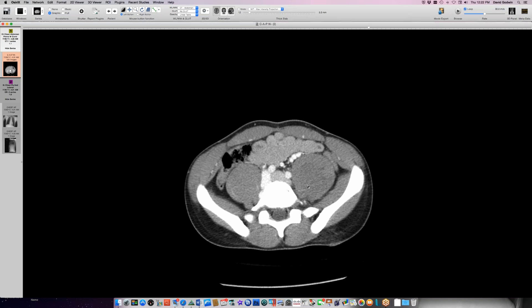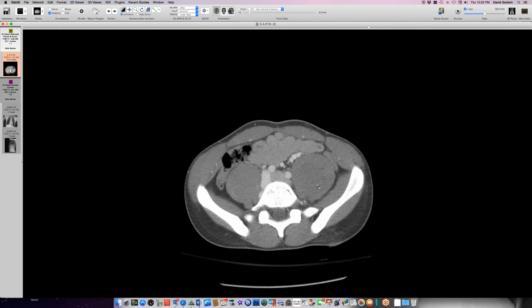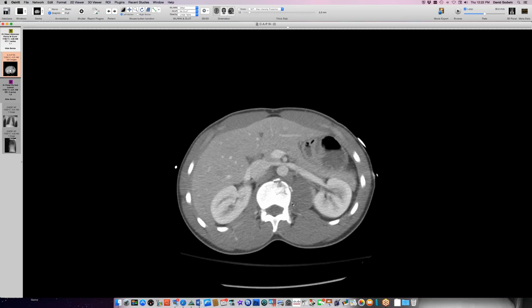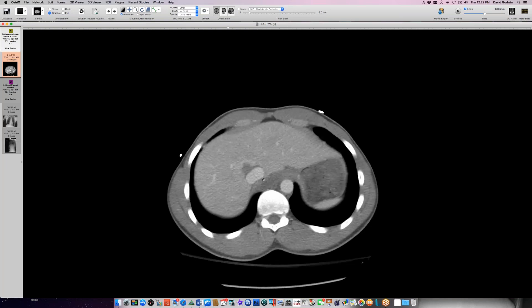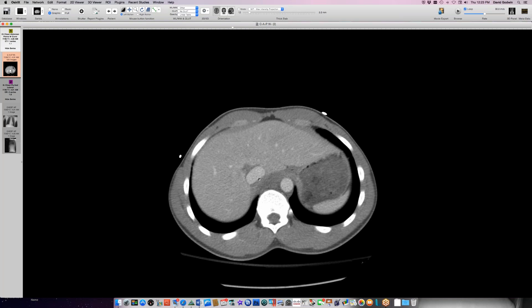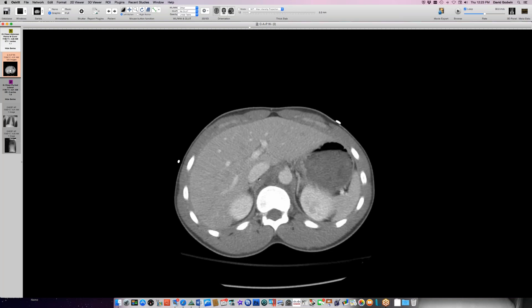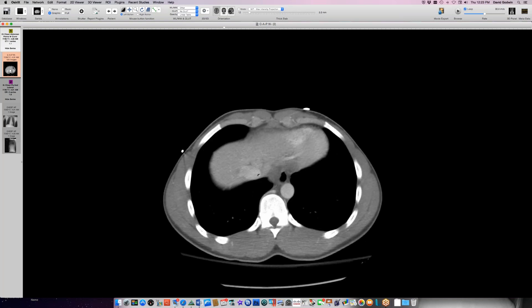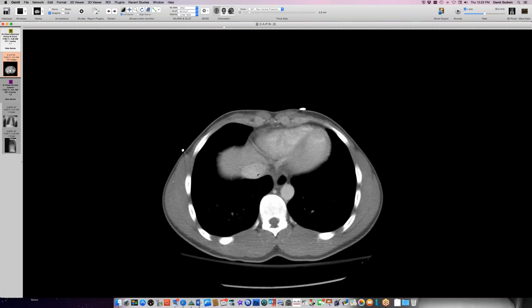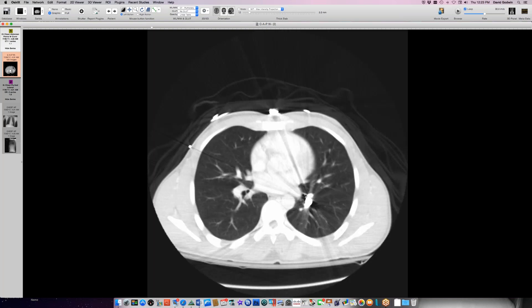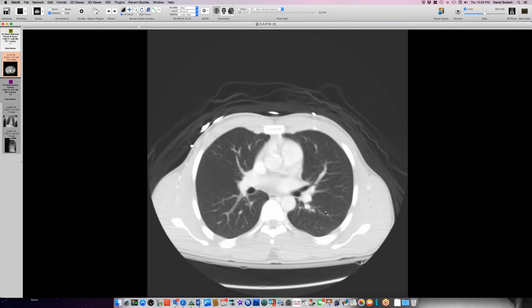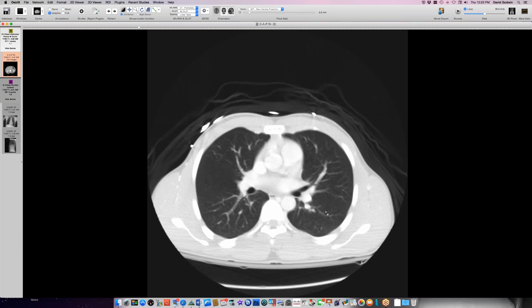Going back to the CT scan from Alaska, we can see where the bullet entered down here. The person was hit in the flank — notice the swelling of the psoas muscle with a hematoma. As we go higher, there was some damage to the vertebral body. The bullet moved obliquely upward and I think ended up in the liver, having perhaps gone through the inferior vena cava, because there's a little edema around the cava. I presume the bullet got into the cava, probably in the liver, and then traveled into the lung circulation, lodging in a left lower lobe pulmonary artery. This is a case of bullet embolism — a big surprise to the internists here, because they don't see trauma the way the Harborview surgeons do.